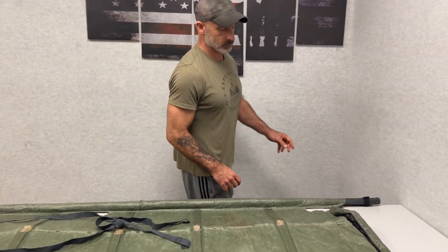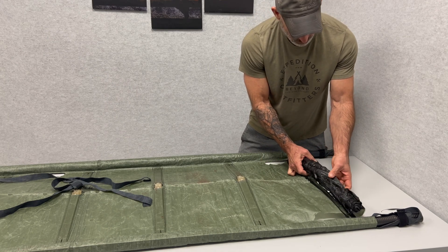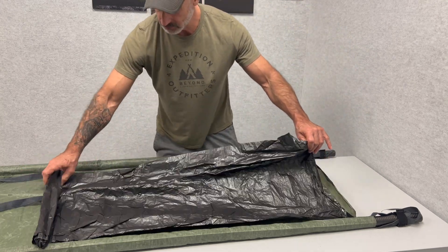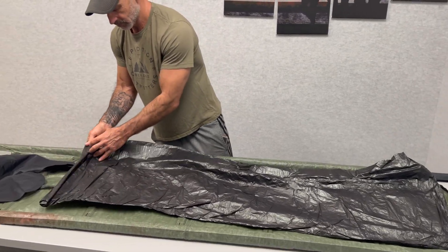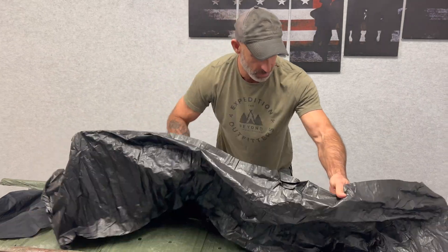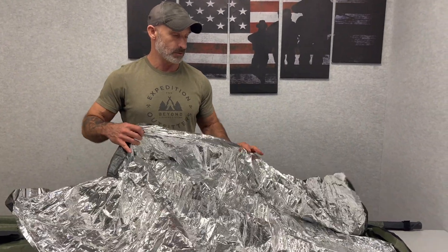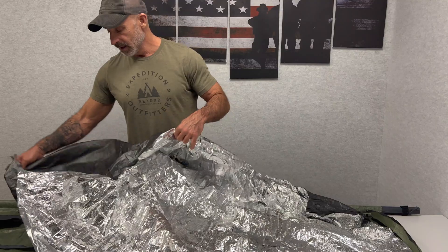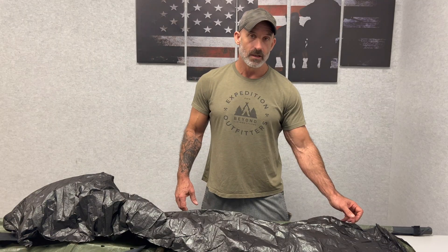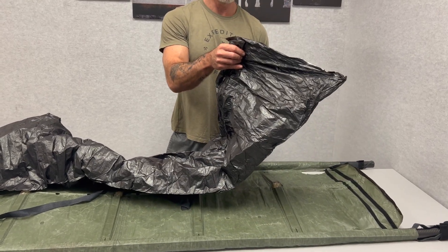On the bottom, if I un-Velcro this piece, I have a space blanket that rolls out and can cover the patient. We've made this upside down, so you'd just flip it over — it covers the patient and keeps them warm. The space blanket also rails on and off so you can keep the blanket with the patient.